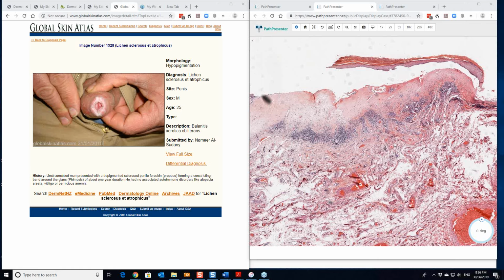I mean, this again is a chronic stage where separation and blistering is occurring. There might have been some bleeding in here showing that hemorrhagic change that we showed in the one before. But it's a very distinctive pattern. Usually, it's very different to, obviously, erythema multiforme, graft-versus-host, fixed drug. So you really should be able to pick up bullous lichen sclerosus quite easily.